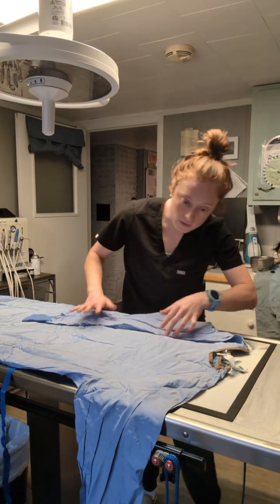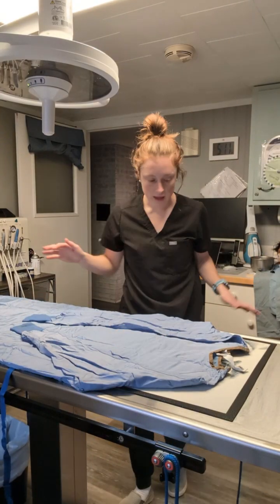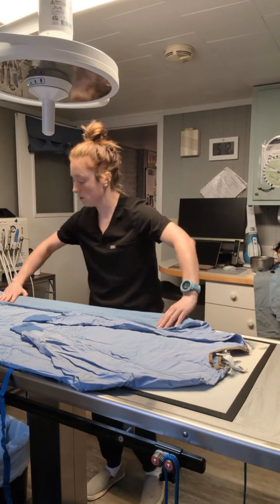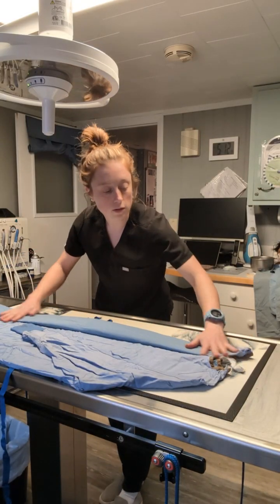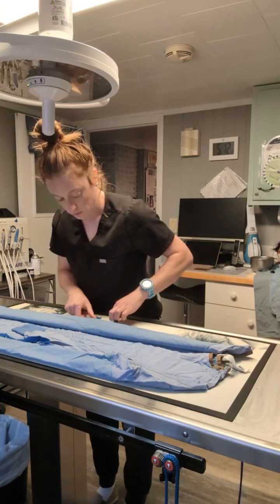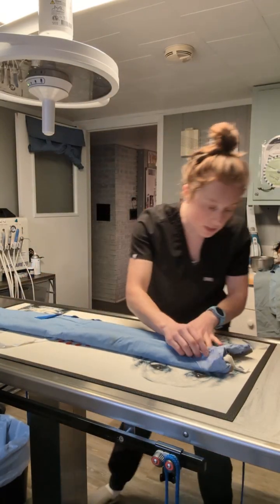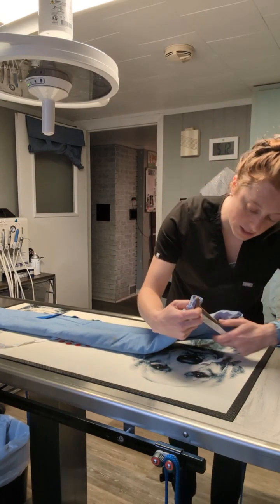And I want to fold the arms forward. And then I want to fold both sides in, maybe about 3 times, so that they meet in the middle and there's enough space to still access that collar on the back side.